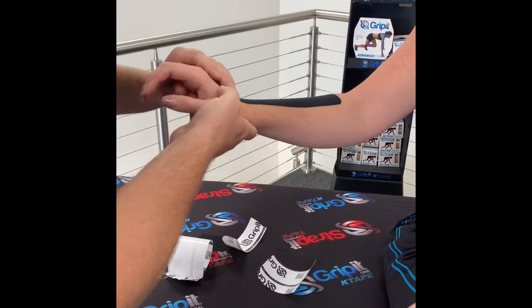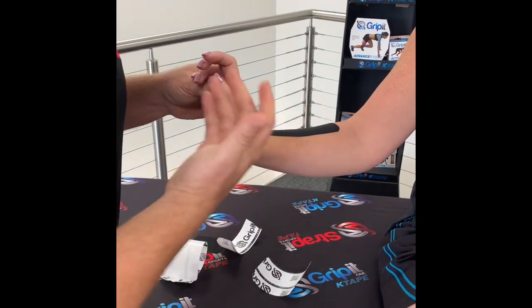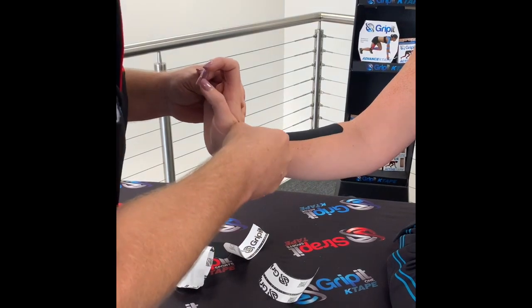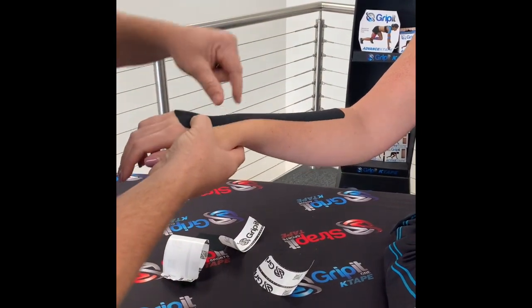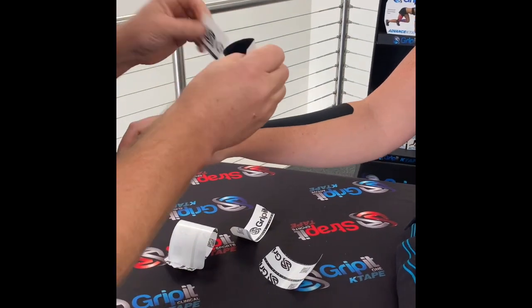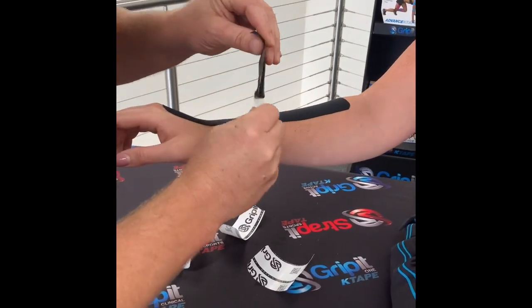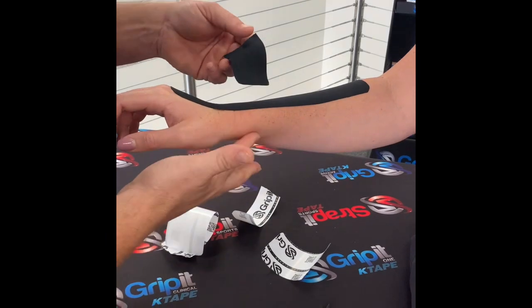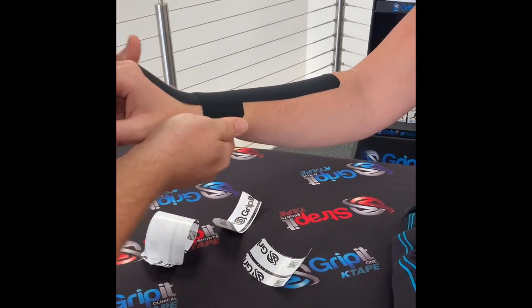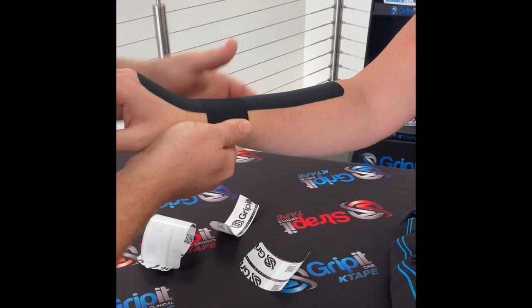The only other thing you need to think about with these joints where extension is in the shortened position is this extension closed position, you may need to apply a strip of tape over here. So just a quick example, you like this a little bit longer, but that's one we have here now. I'd prefer to go around here and we just apply the tape, really no stretch, just to sort of support that area that has the chance to lift.